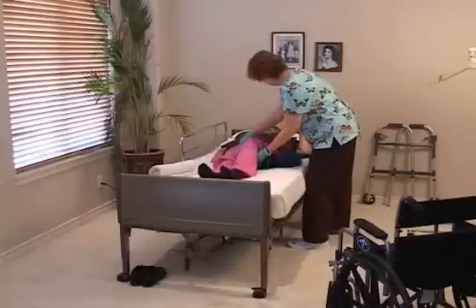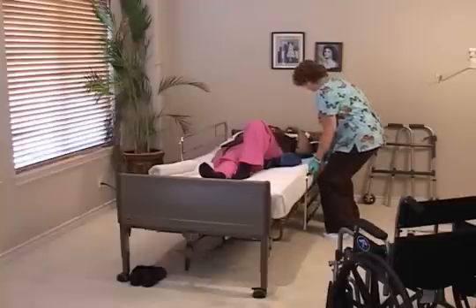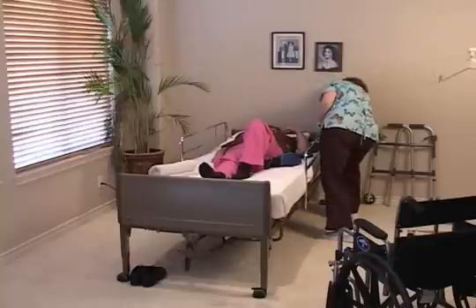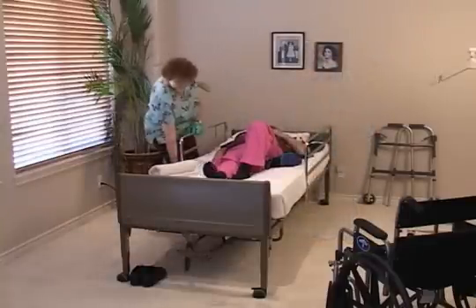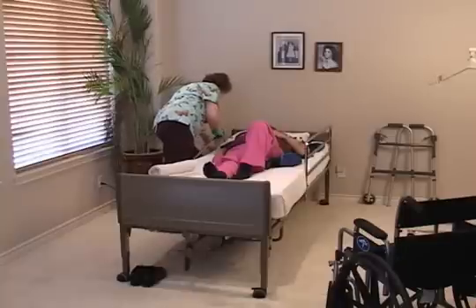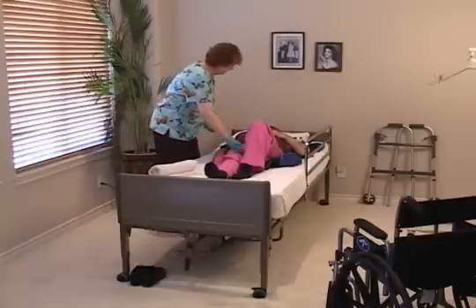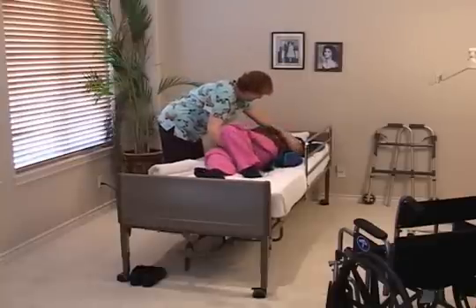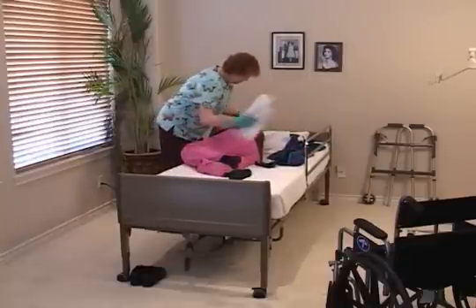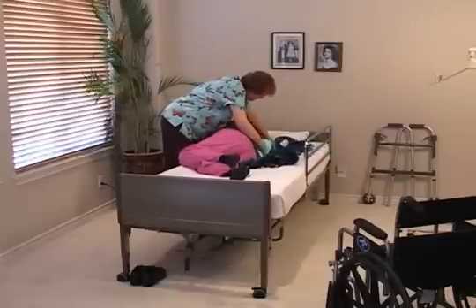7th, lift the resident's leg closest to you and have the foot placed flat on the bed. 8th, raise the side rail and position yourself on the other side of the bed. 9th, lower the bed rail and gently grasp under the knee with one hand and under the shoulder with the other hand. 10th, roll the resident towards you and place the wedge such as a rolled up towel at the back if the patient cannot hold the side position.